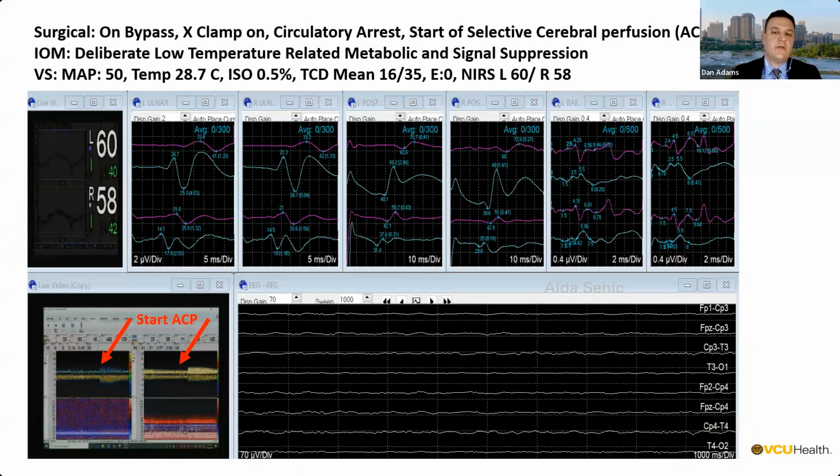It is important to note that when only the brain is being perfused and air emboli are present, there is a very short window of time to react because the air emboli are isolated only to the brain circulation.